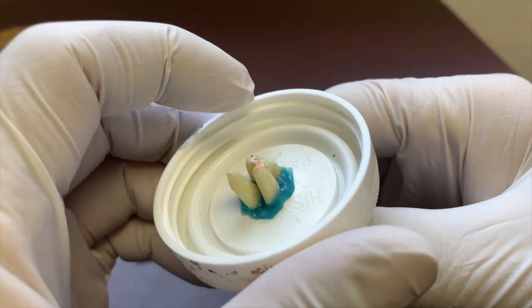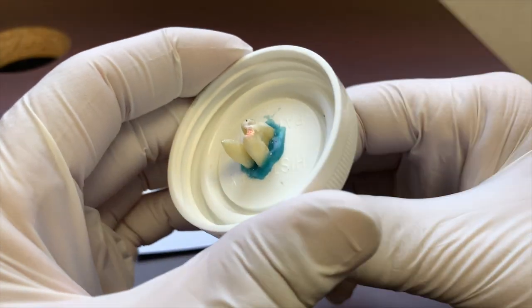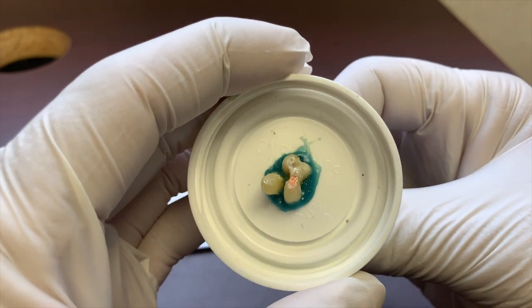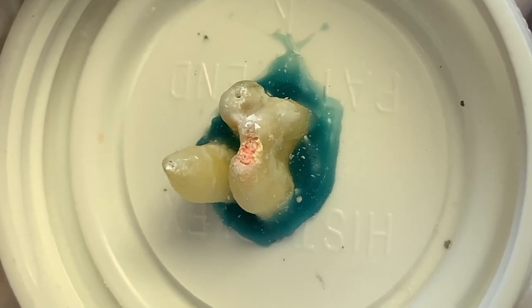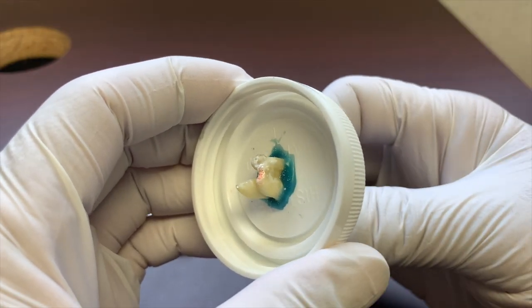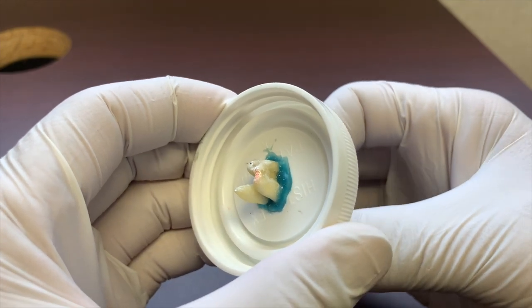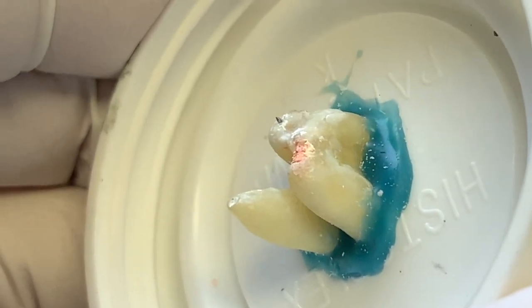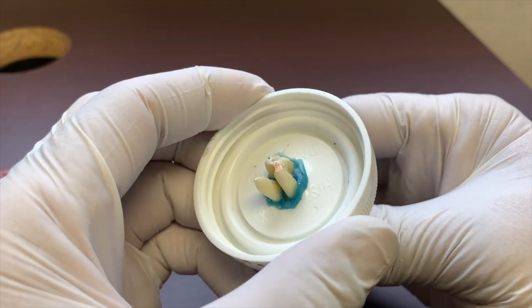So we're going to open this up and machine the inside of our canal. But the problem is that when we go to our working length, the canal is so big, the apical portion is so big, that you might not get adequate debridement, machining of the internal aspect of that tooth. So some people can gauge it and run the file long a bit. You could do this by hand using the balance force technique, or you can run it long, whatever you want.